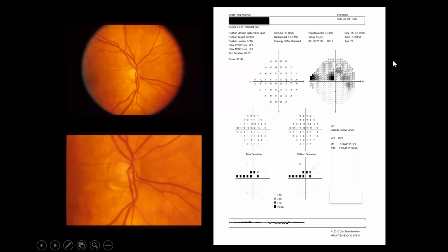Okay, so what you mentioned, Khalid, here are very important information. You mentioned that this is the right eye. How would you know that this is the right eye? Because when you look at the blind spot, it's on your right hand.